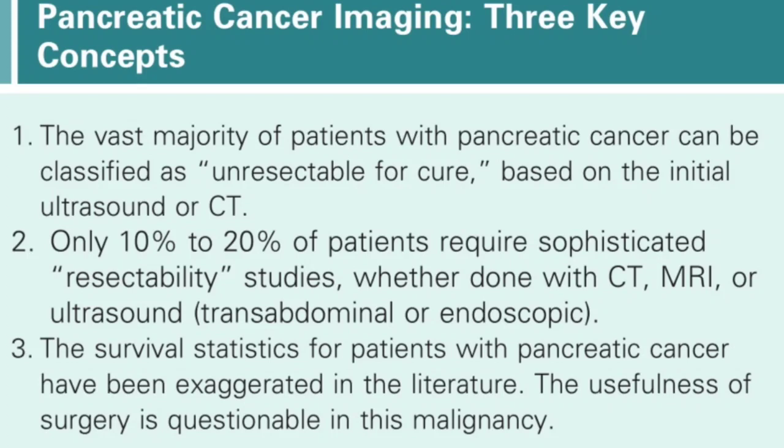And the second thing is, one should keep in mind that only 10% of tumors are resectable at diagnosis, with an overall 5-year survival rate of only 2 to 3%. So I have mentioned the unresectability criteria on CT scan and Doppler imaging, and besides this I have also discussed the resectability criteria on these imaging.